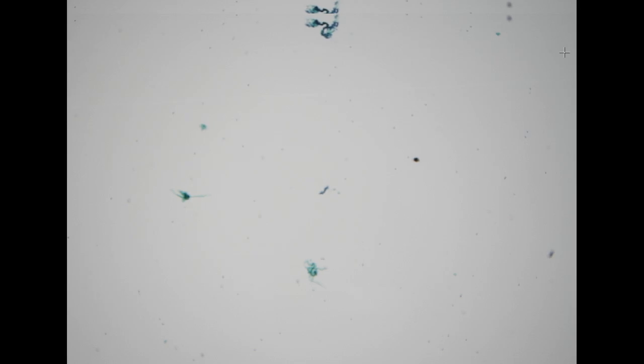So usually the suspicious category would most commonly apply to a paucicellular specimen where we don't have enough diagnostic material to call, or we do have a hypercellular specimen, but the degree of nuclear atypia is equivocal.